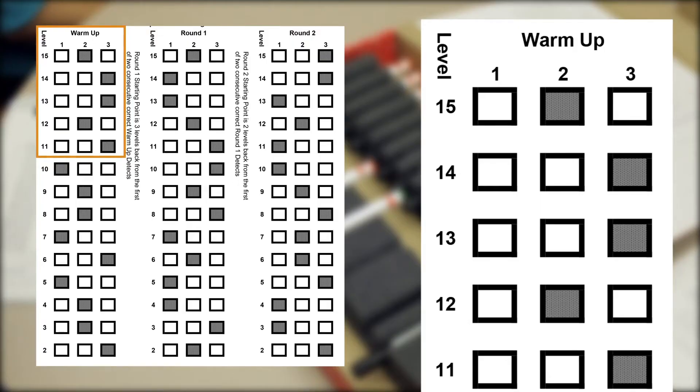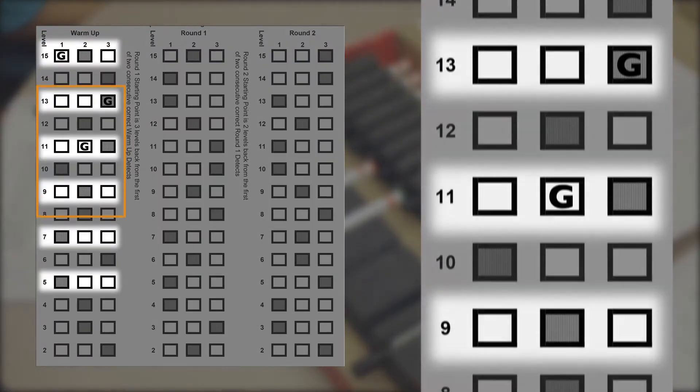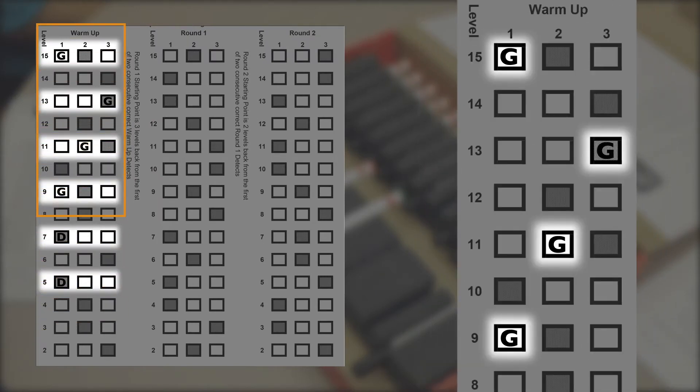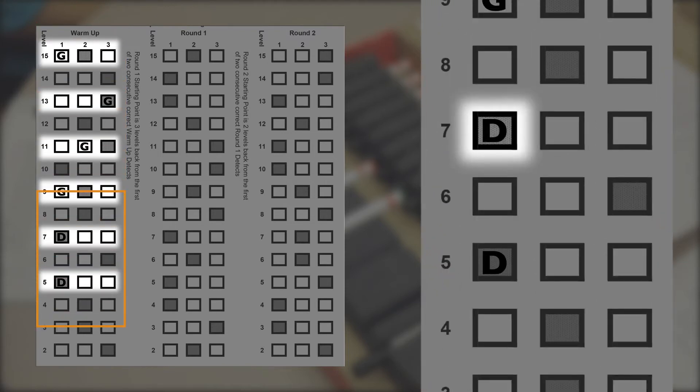Sniff, which pen? I detect number one. Let's review the warm-up. We see the test administrator presented every other pen sequence starting at pen number 15. We see the test individual was initially guessing. At pen number seven, the individual correctly detected the first pen in the left position. At pen number five, the individual again correctly detected pen number one. The warm-up was stopped after this confirmation.